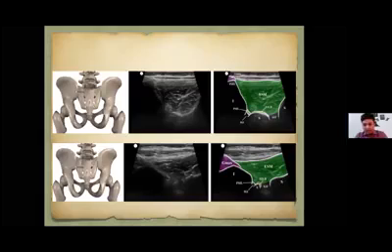Here you can see in this figure, this is at the S1 foramen. Here is the sacroiliac joint, and this is the S1 foramen. So you need to go a little medial to lateral here, while in the S2 foramen it is quite easy to do. Not that much angulation is needed, and less depth is required also. So it is better to go for the S2 foramen.